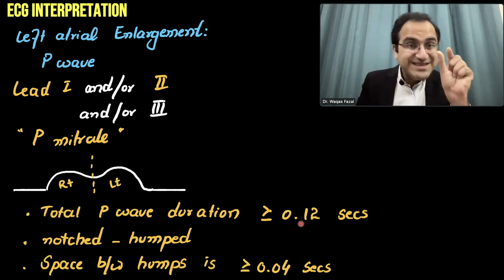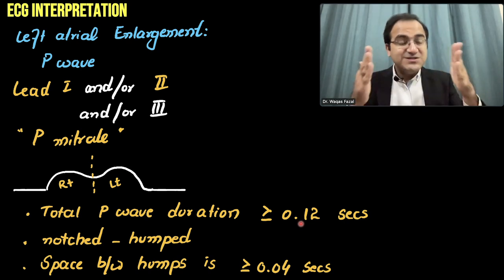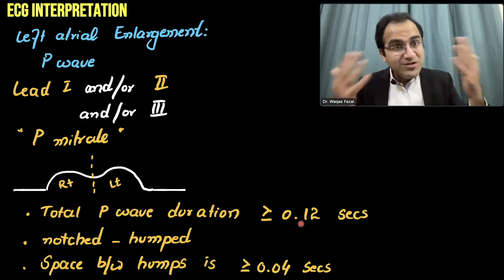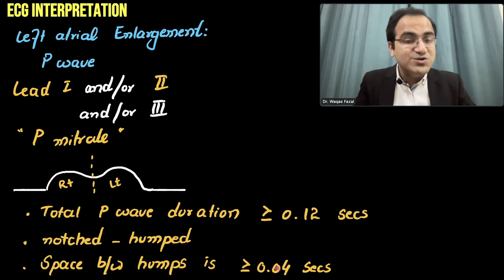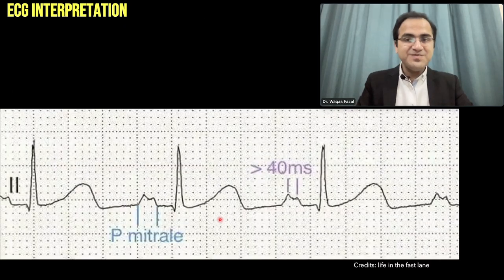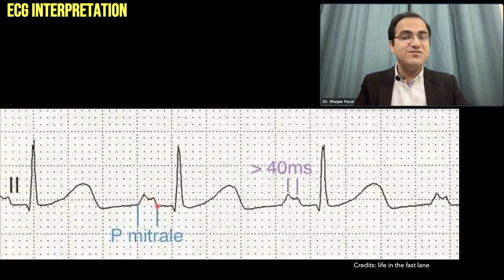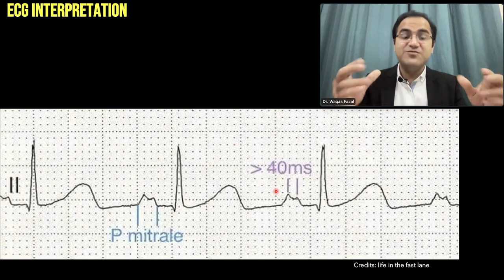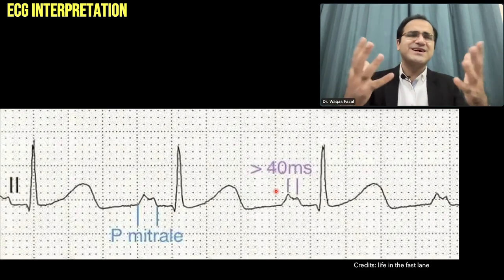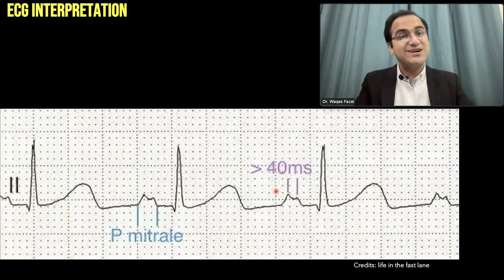0.12 seconds is equal to 3 small boxes, so the P wave will be 3 small boxes wide or more. It will be a notched or humped P wave, with space between the two humps equal to or greater than 0.04 seconds — one small box. This ECG shows P mitrale. Look at the double humps of the P wave — it is 3 small boxes wide. That is a wide P mitrale with a notched or humped P wave, which is a classical presentation of left atrial enlargement on ECG.